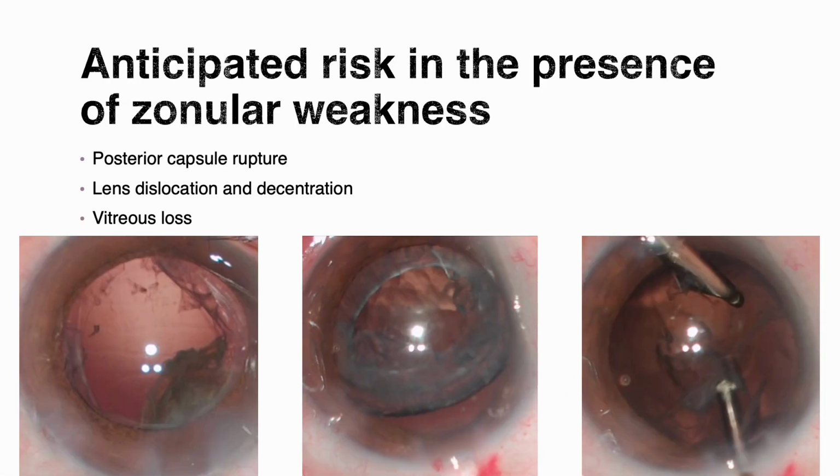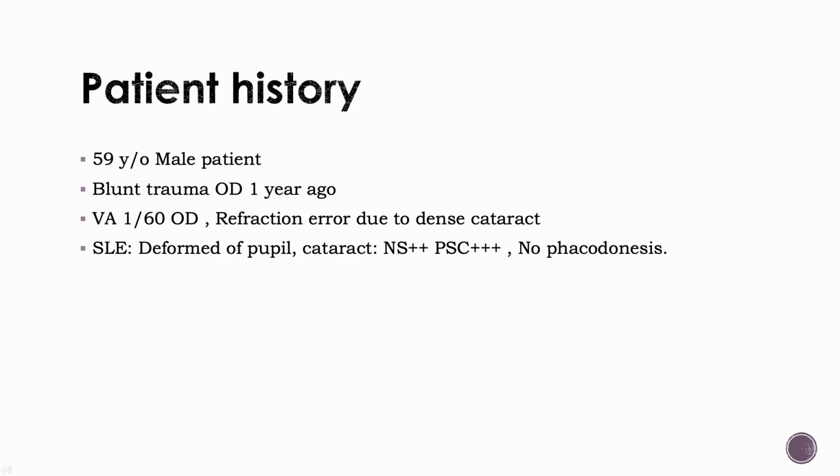There is anticipated risk in the presence of zonular weakness, such as posterior capsule rupture, lens dislocation or decentration, and vitreous loss. This is a 59-year-old male patient. He had a blunt trauma history of his right eye about 1 year ago. His visual acuity was 1/60 in his right eye, and the refraction data was in error due to dense cataract. Slit lamp examination showed deformity of the pupil, nuclear sclerosis with dense posterior subcapsular opacity. There is no phacodonesis.